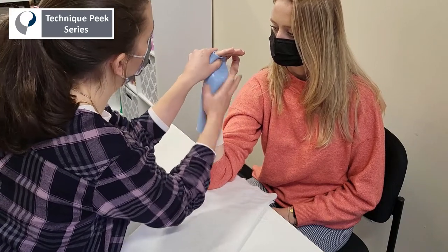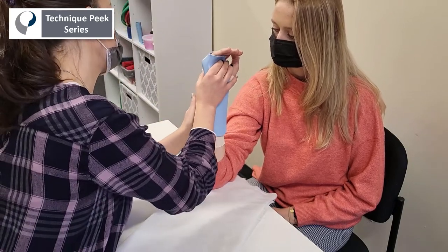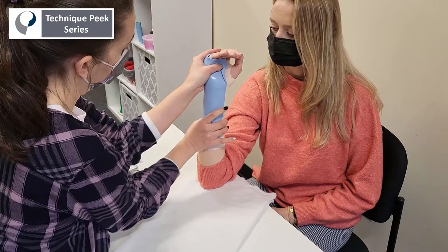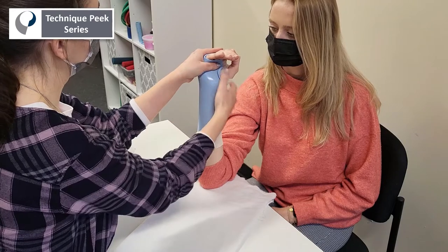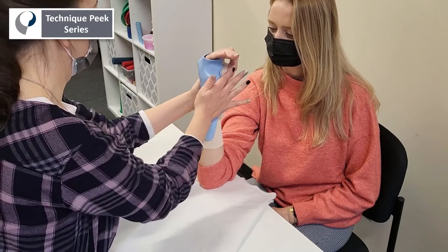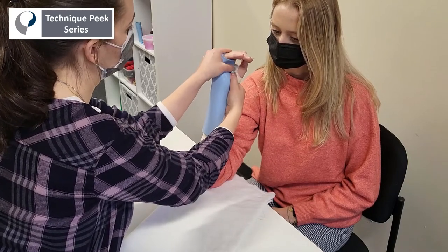Next, we're going to clear the thenar eminence to ensure ease with opposition. We're also going to check that the PIP joints are clear. If you notice, the therapist's left thumb is providing some pressure at the crease of the metacarpal, and that ensures a tight, secure fit in that intrinsic plus position. Smoothing it out, we're also ensuring that the ulnar styloid is going to have a nice bubble there, and later you'll see how we repurpose the pad to prevent any skin irritation at that pressure point.